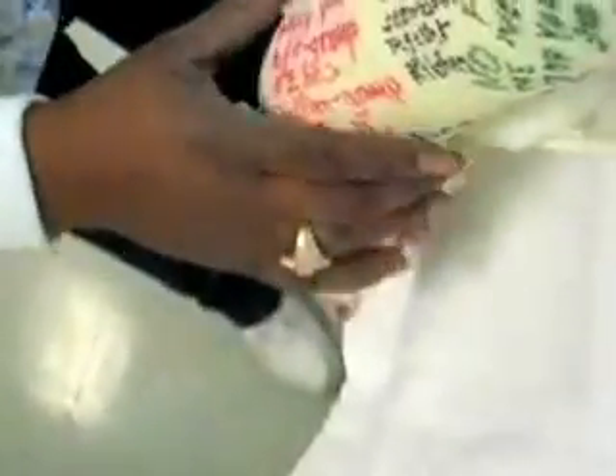Is there any chance I can keep the cast? You can, if I could find a way to get it off. Let me just loosen it, see if it won't loosen easy. What we're going to do is some restraint on the wrist. Not any pain, but it seems like it's going to be a struggle to get it out. I'm going to cut some more on the underside here, and that should make it work.